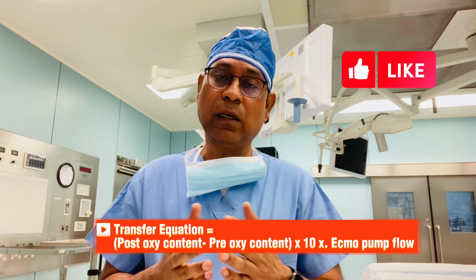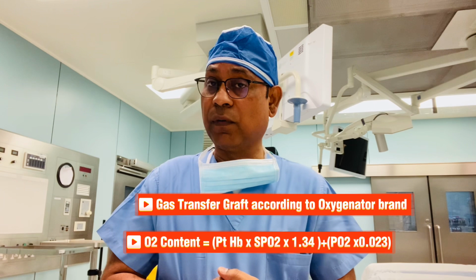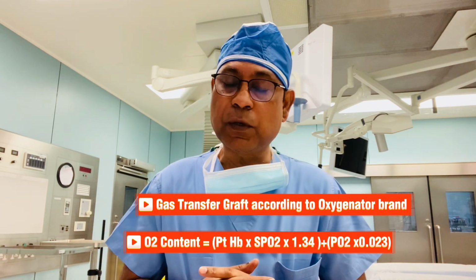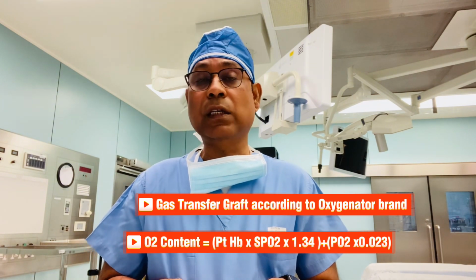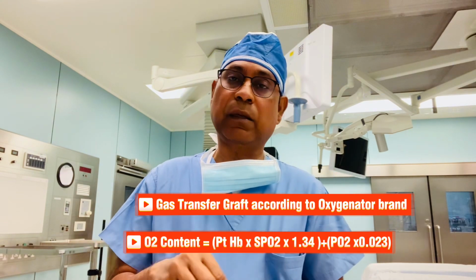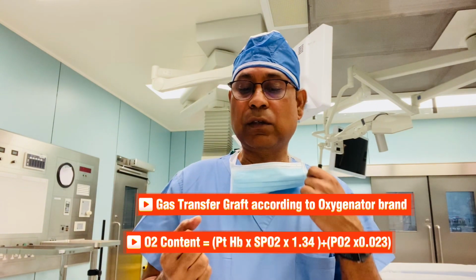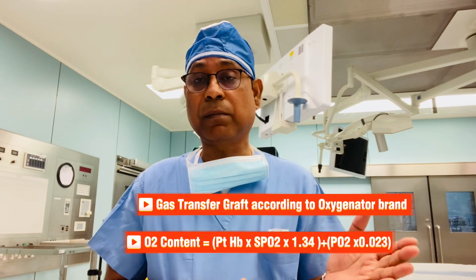Before that, we need to understand how to get the oxygen content. The formula for oxygen content is Hb times SpO2 times 1.34, plus PO2 times 0.023. By putting in this equation for the post-oxy and the pre-oxy, you will get the values. Then you implement the transfer equation: post-oxy minus pre-oxy.